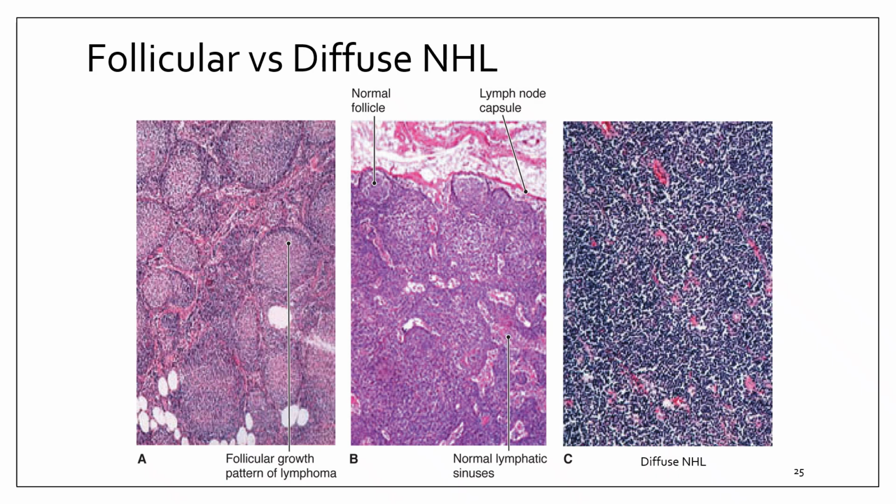Let's start with what good looks like. In a normal lymph node, you should see a capsule and cortex with follicles. You should see germinal centers and intervening sinuses. So clear organization. Think of it like a well-organized grocery store. Produce in one area, dairy in another, aisles clearly labeled, and everything has a place.